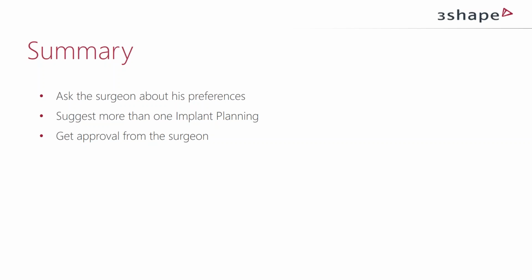So we have some questions. I think this was what we had in plan for the schedule. We have some questions that we want to cover as well, which have come in from some of the listeners. The first one is related to Implant Studio and the reports that we output. It asks when the surgical drill sequences of the actual surgical kits from different manufacturers will be available in Implant Studio.